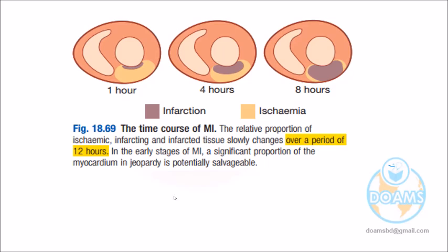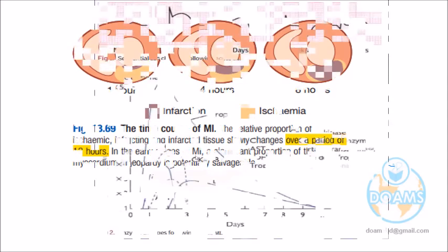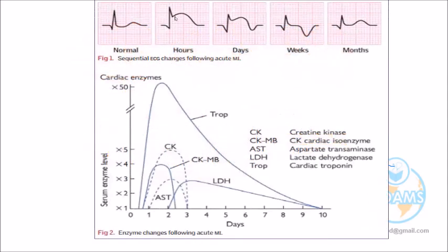So for early detection of MI, sometimes the ECG can detect it, sometimes it cannot. It is the ECG limitation. Still, ECG is very important when troponin I is not high but the ECG shows the change. If I go back again, you see, in 1 or 2 hours the ECG may be high up, but it may not be; falsely, it may show normal. This is the fact. So at that time we rely on the chest pain.